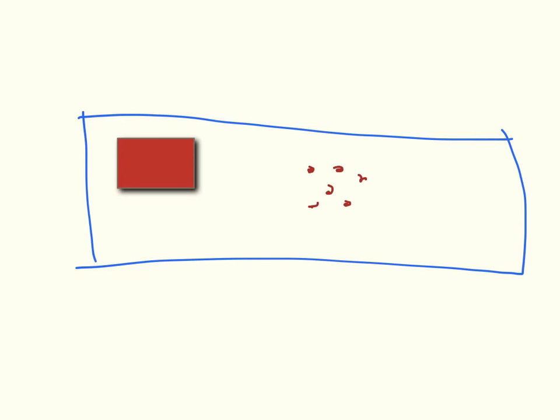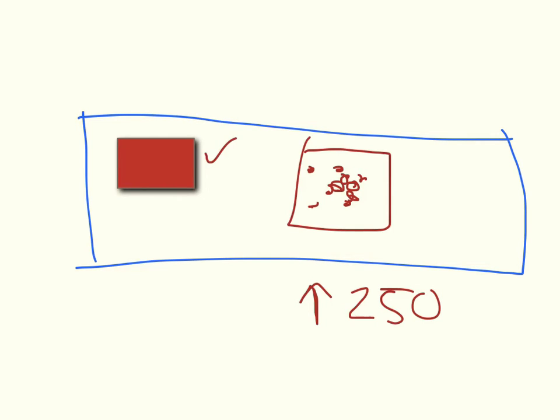The small dots will appear until the number of erythrocytes increases beyond 250, and at that point they'll start to coalesce. So if the erythrocyte number is low, you can actually distinguish between hemoglobin or myoglobin and actual hematuria.